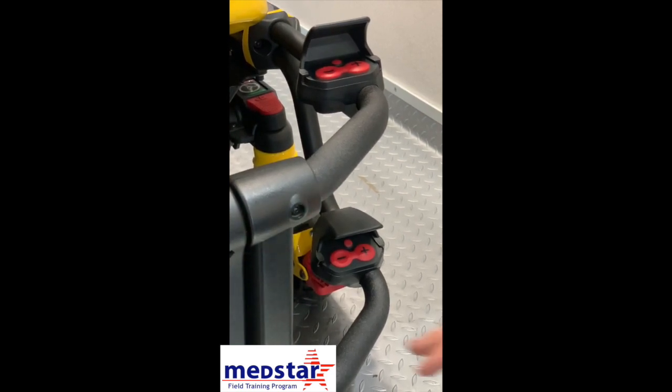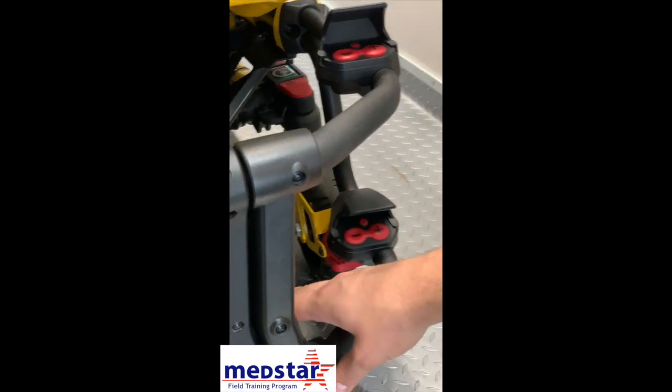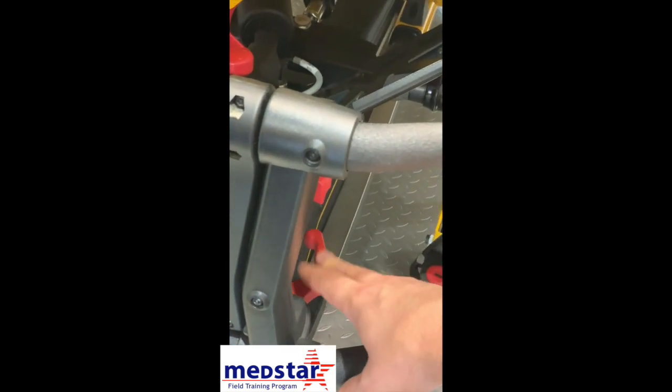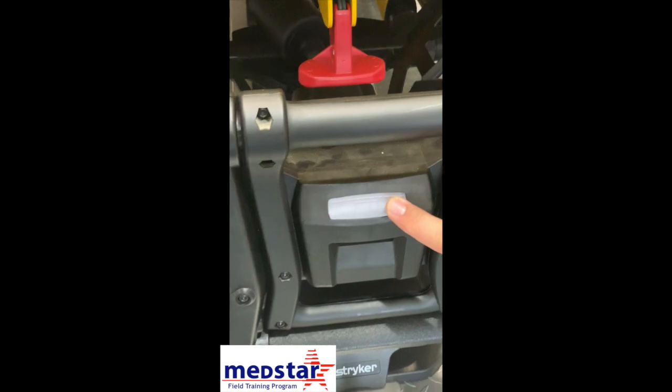We're also going to go over the manual release on the stretcher. There is a manual handle on the back side of the stretcher. It is noted that it's on the right side instead of the left side. Manual stretchers have the handles on the left side. The power stretcher has the manual release on the right side. We're also going to talk about the indicator light for the battery.